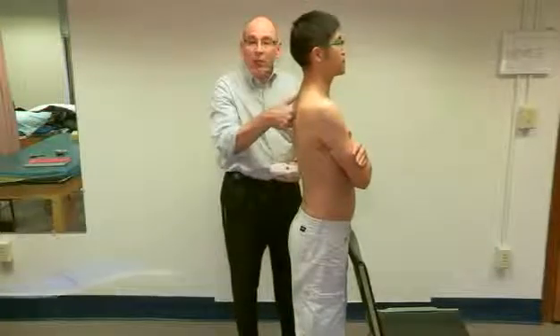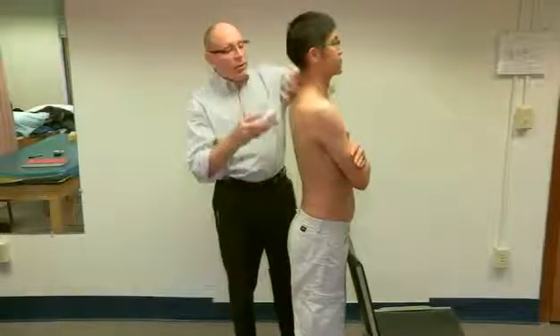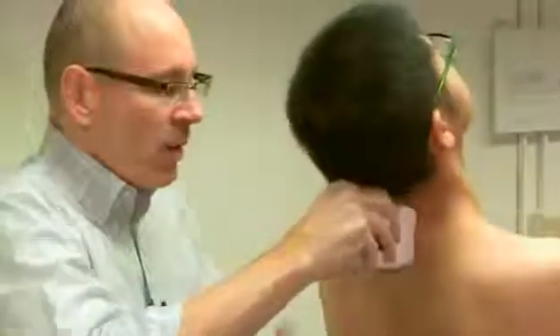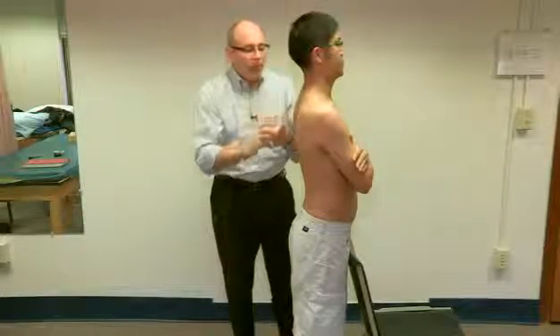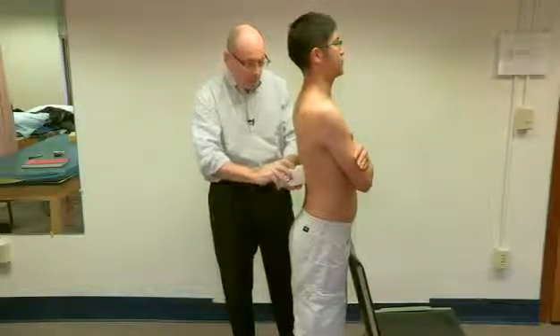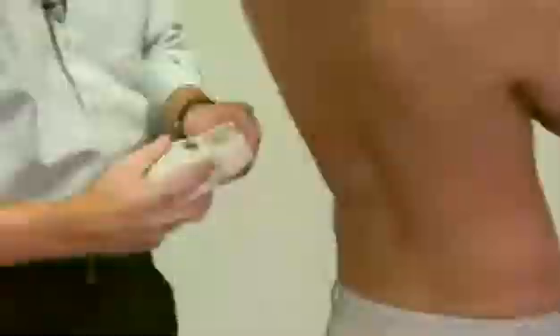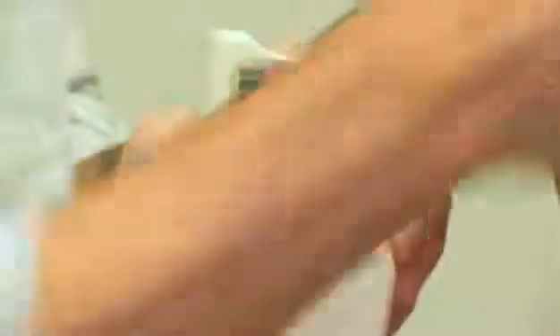Continuing, we look at the thoracic spine in extension. The subject remains against the chair. I come up to the C7/T1 level and place the inclinometer there. Back as far as you can. We obtain 39 degrees. To find what we can attribute to the thoracic spine, I reposition and the subject extends again, yielding 21 degrees. We subtract this from 39 to find the thoracic contribution.